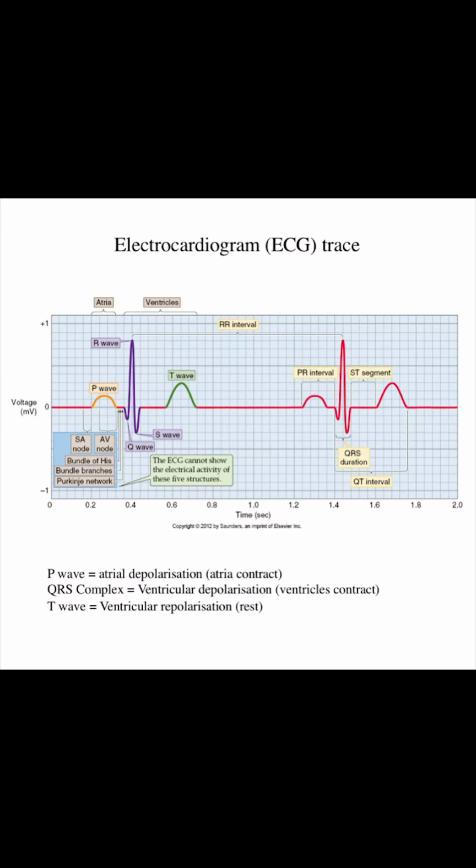This diagram provides an explanation of an ECG trace showing the initial P wave denoting atrial depolarization, followed by a rapid QRS complex which demonstrates the large ventricular depolarization and the subsequent blood ejection from the heart. This is then followed by the T wave showing ventricular repolarization. In this activity, we'll be using the ECG to calculate the cardiac frequency and the R to R interval as seen on this diagram.